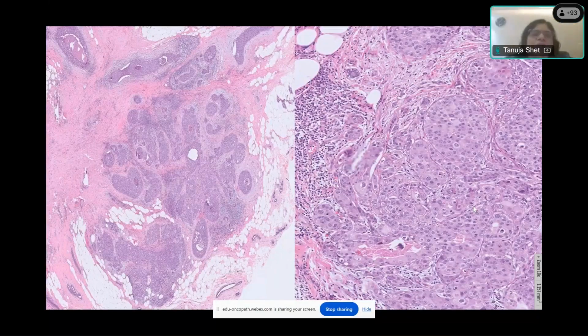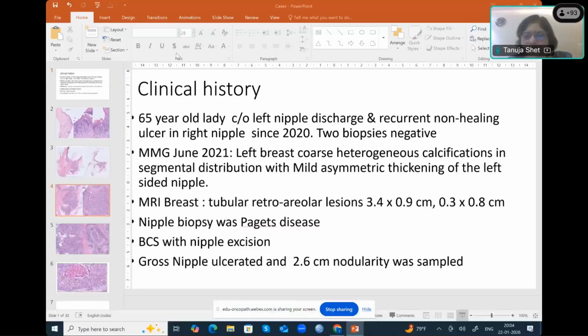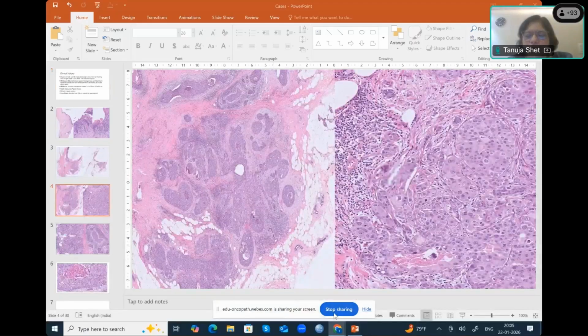What if I tell you it's in situ? Because you see here there is DCIS, right? These are all DCIS. So actually, what you're seeing here, Swara, it's Swara, right? I'm sorry, I can't see your live feed. So what has happened is this is a main duct. From that, again, my laser pointer you want, right? Okay, let me go back. No, I don't have to stop sharing. Go full screen and look for the pointer options.